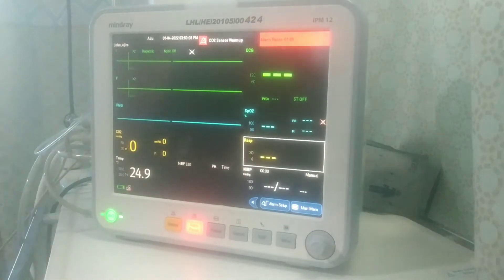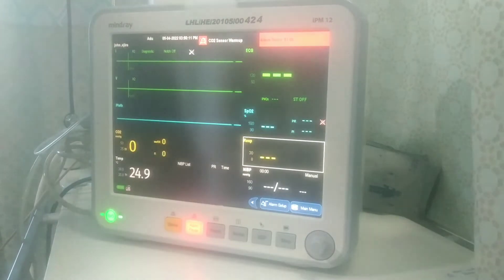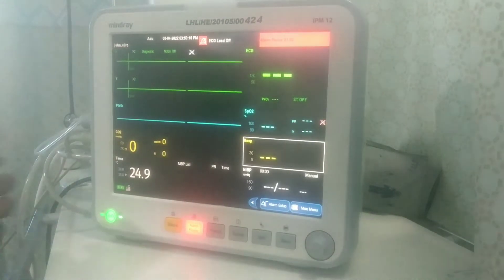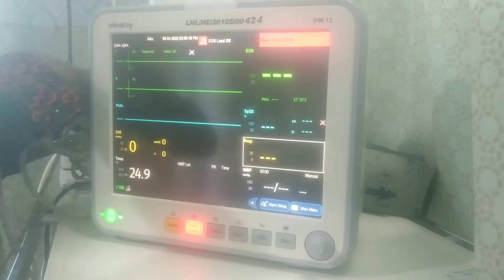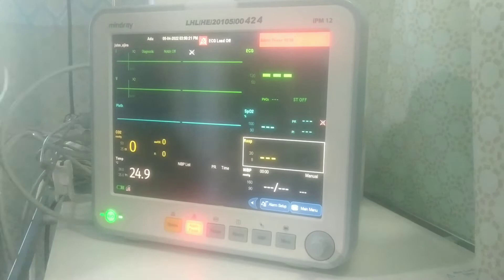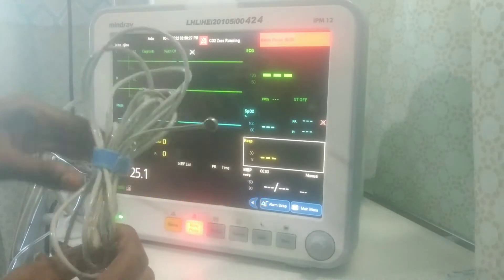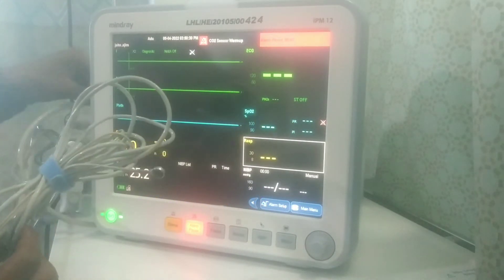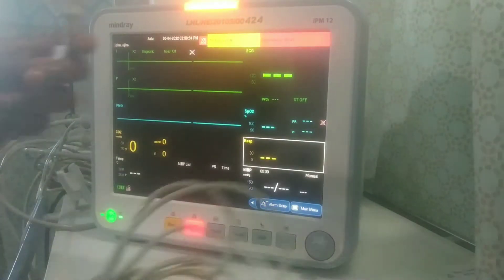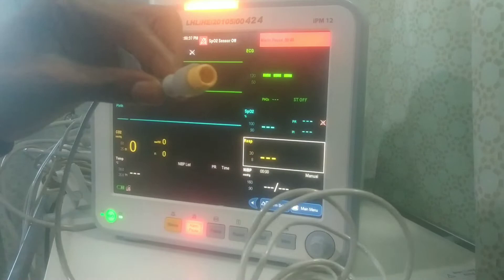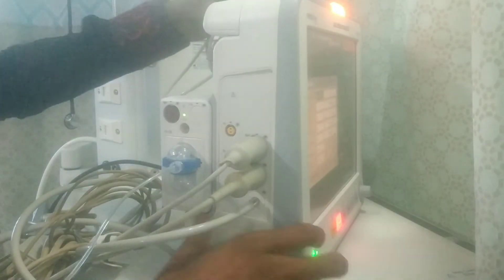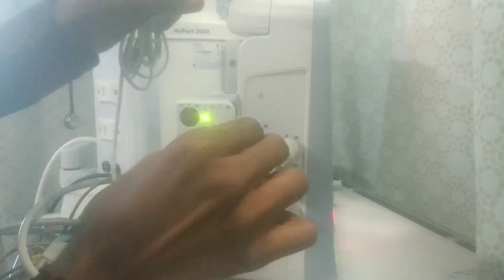Now the monitor is on. First I want to show you the temperature probe. Right here is the temperature probe — I hope you can see it clearly. This is the connection; this is how it looks. There is a port here where you connect it. If you look closely you will see T1 and T2, so you can connect to any of those ports.